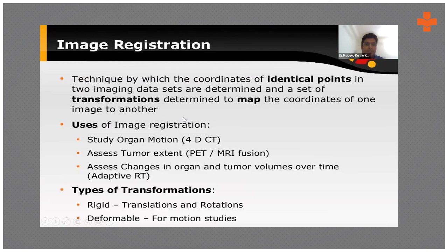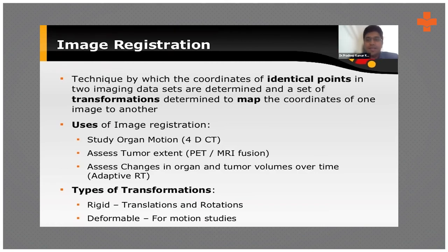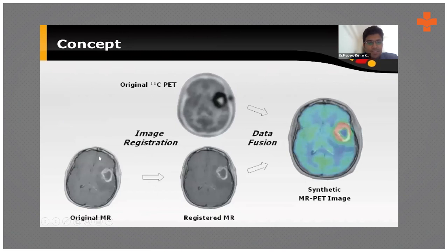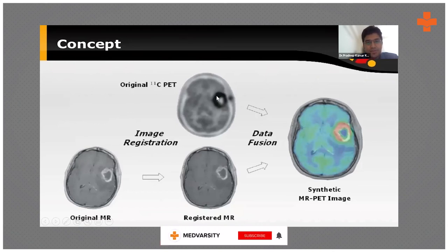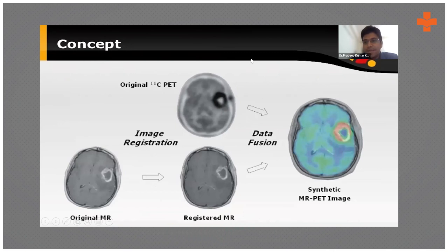These techniques can be fused with our radiation plan through image registration. After acquiring all diagnostic and planning data, we can fuse them exactly point to point. If there is organ motion, we can utilize 4D CT to capture that motion as well. You can see the original MRI with an enhancing lesion, the registered MRI, and the PET-CT scan. These two are fused to create combined data, and based on higher and lower activity enhancement, we can adjust our radiation plans.